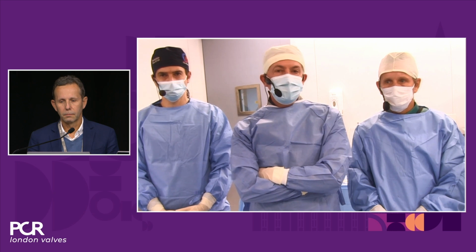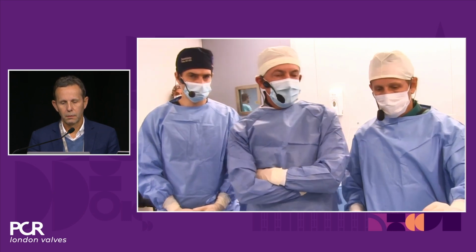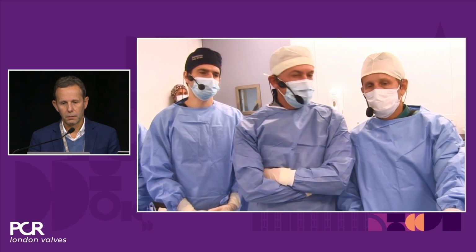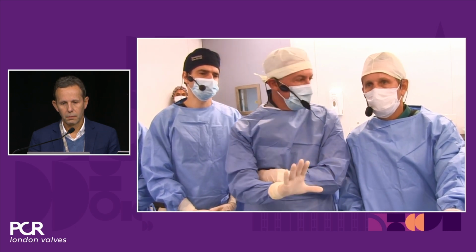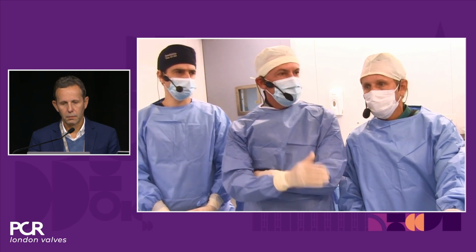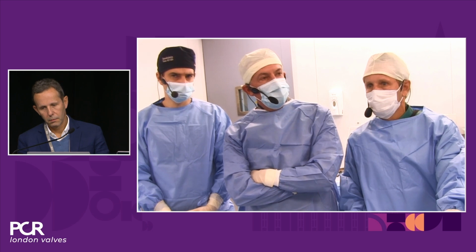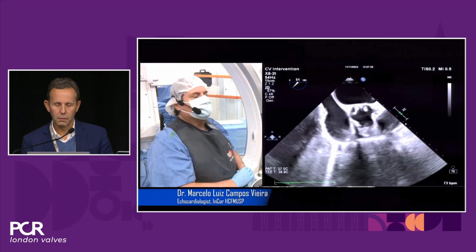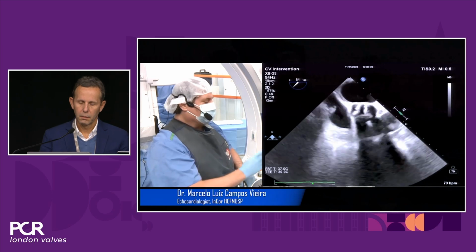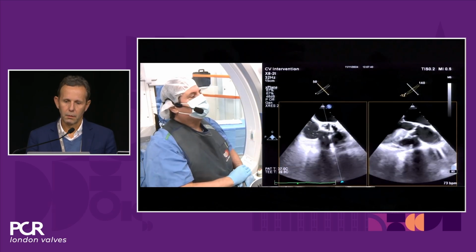Well, I guess that for this zero contrast protocol, Fabio, it's important to highlight the importance of TE during the procedure. We're not going to use any contrast, so we're going to be essentially guided by transesophageal echo. Marcelo, can you give us some insights of what you see before the procedure? Absolutely, Alex. We're going to use just 2D and 3D TE. We have here a transversal view as well as a longitudinal view.